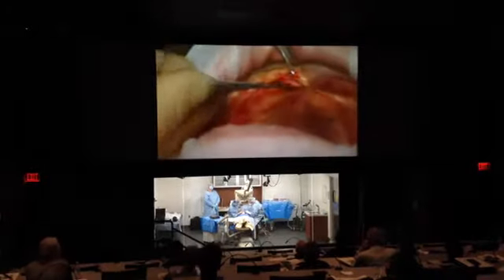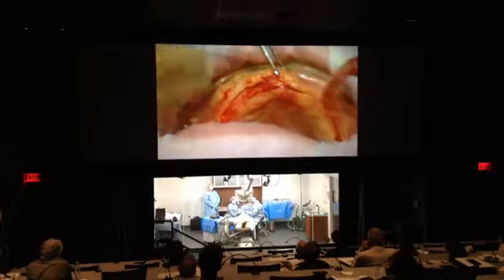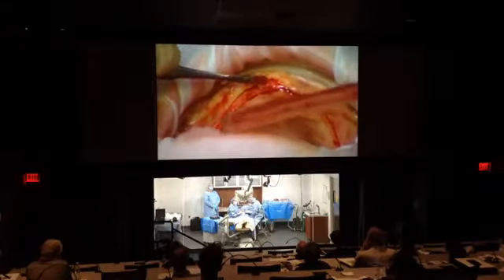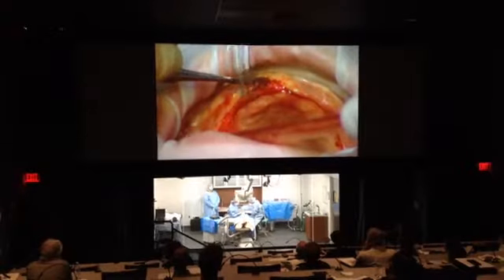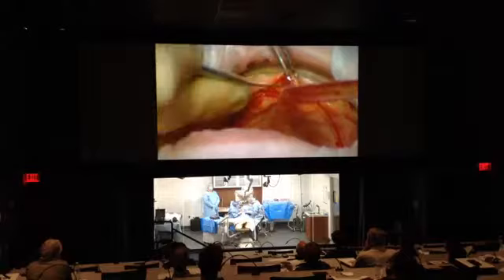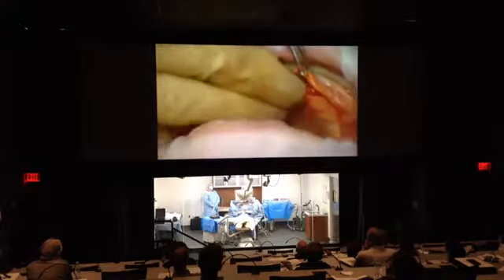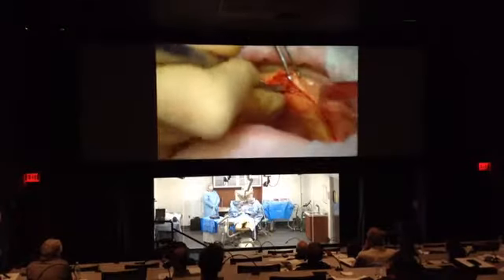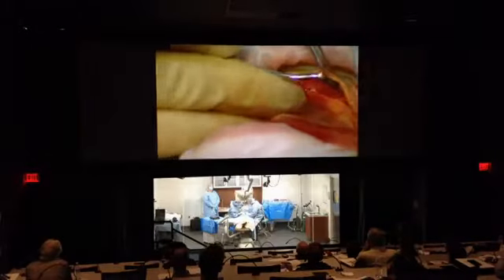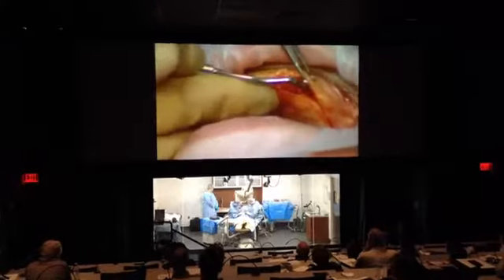Very important to hold the flap and have a good tissue plier. On the other hand, I don't like to use something with teeth. The tissue pliers come with teeth or without teeth. This one I like best because it's wide and it doesn't create as much damage to the tissue as I'm holding it. The pliers with teeth, yes, they hold the tissue better, but there's additional damage that we can create in the tissue. Okay, I'm also using the back of that chisel to push the flap.